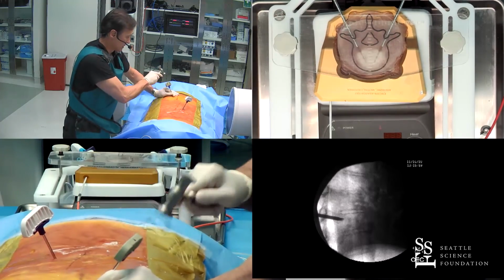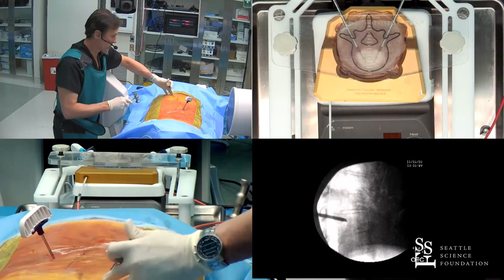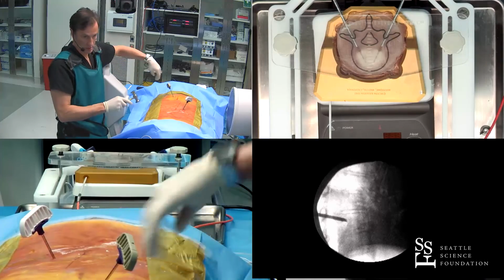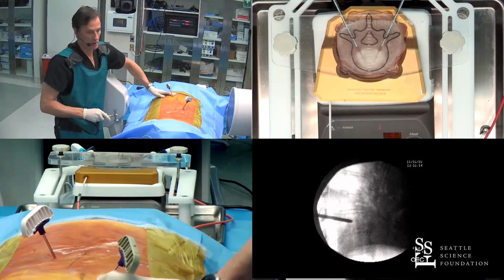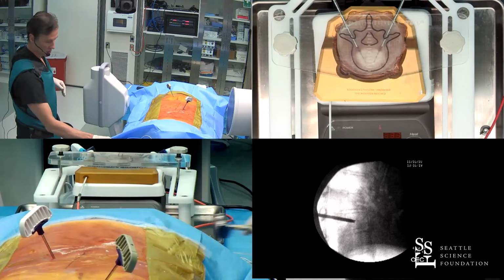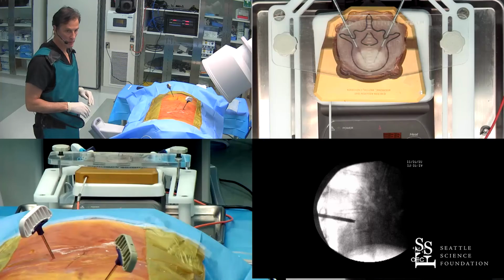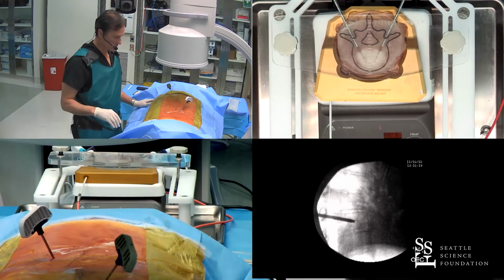We'll take it into, let's put it kind of in the middle of the vertebral body. All right, and we'll take a look on AP, perpendicular approach of a mid-thoracic vertebral body. And I think we'll be pretty satisfied with the approach.